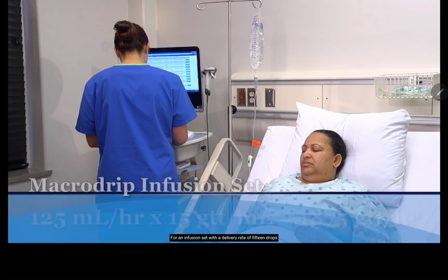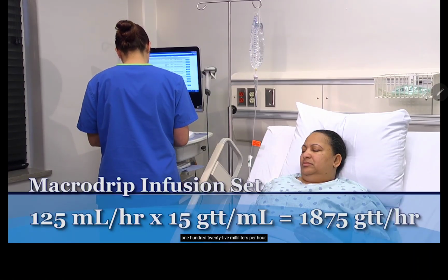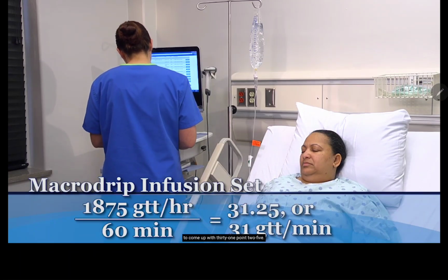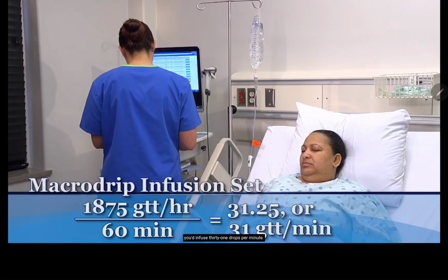For an infusion set with a delivery rate of 15 drops per milliliter that you'd like to deliver an infusion of 125 milliliters per hour, you'd multiply 125 by 15 drops per milliliter. The result is 1,875 drops per hour. Divide that by 60 minutes to come up with 31.25. Rounding down this figure, you'd infuse 31 drops per minute.